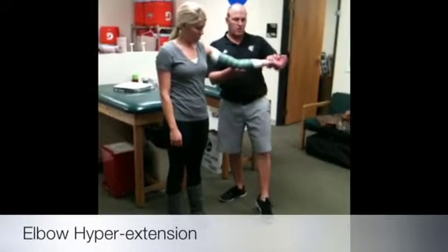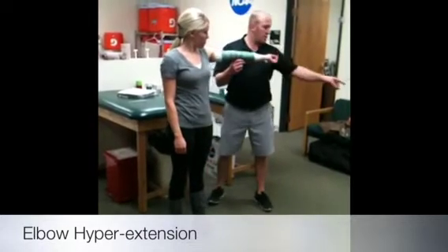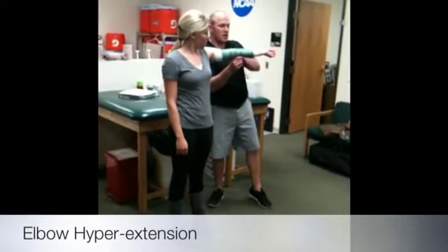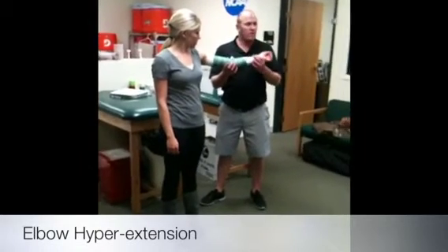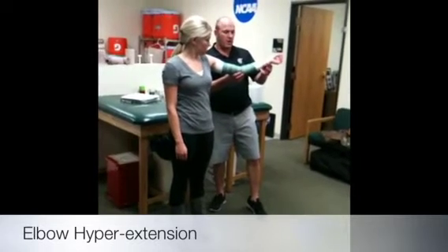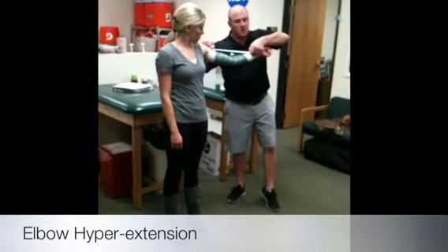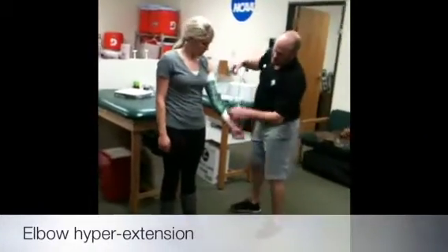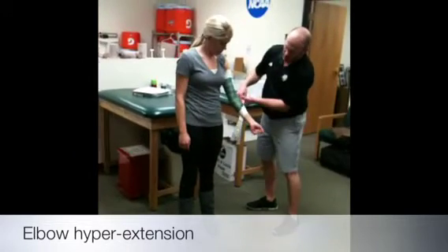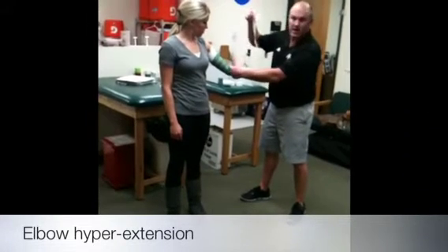I want to get her in a position — so if from this position back hurts, see how hypermobile she is a little bit? Straighten your arm now — see the difference? She's a little bit more than Shiloh, and some people are designed that way, so you just have to find out what works best for her. I can create an X and center it up from side to side, making sure wherever the crease is at is kind of where this X is at. To keep a natural pull, I might have to rotate this in so the X stays right in the middle.